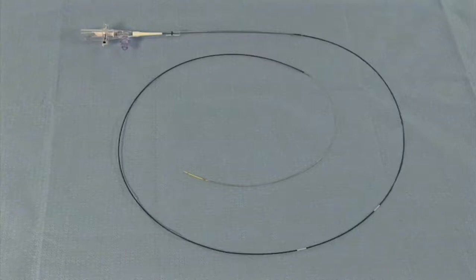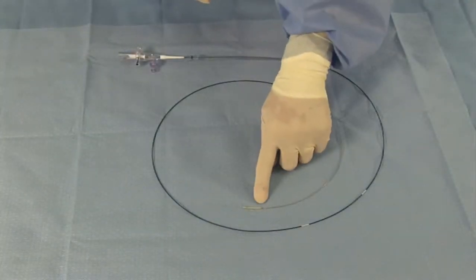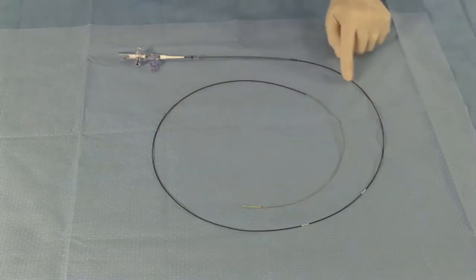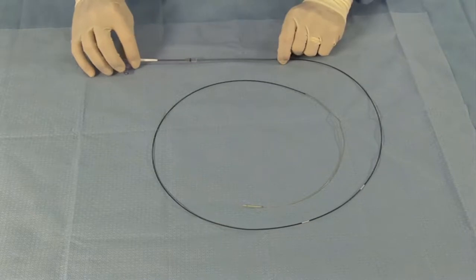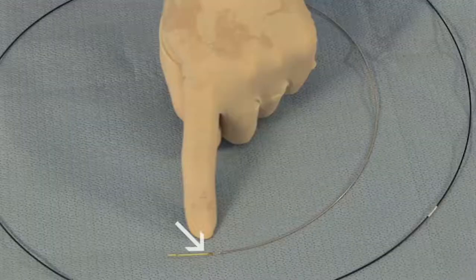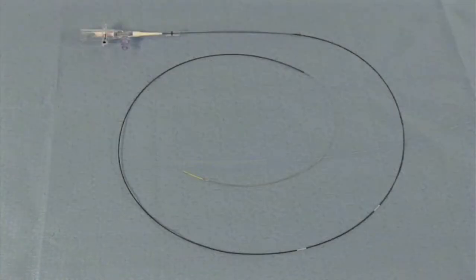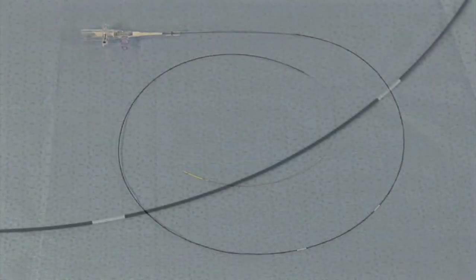The catheter body is comprised of four sections: a distal section, a mid-shaft section, a braided proximal shaft, and a telescoping section. The catheter body has a rapid exchange guide wire lumen with an exit port located 15.5 millimeters from the distal end. One radiopaque marker band is located 0.5 centimeters from the tip. In addition, guide insertion markers are located on the catheter body at 90 centimeters and 100 centimeters from the distal end.